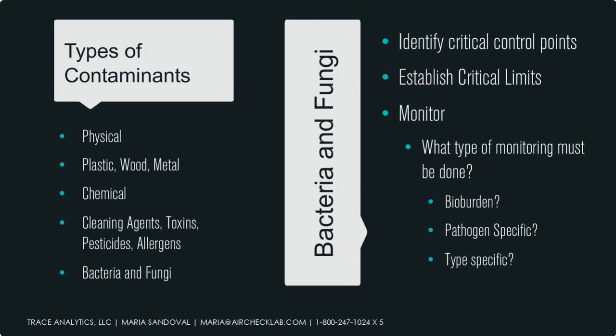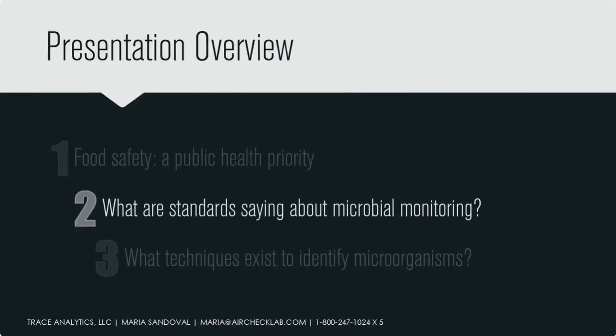Is it good enough to just have a number, or do I need to be pathogen specific? If you've got an entire greenhouse full of spinach, I can guarantee you, you probably need to be pathogen specific. But if you're just boxing up ready to eat meals, maybe you only care about bioburden, or maybe you do care about gram negative organisms. So those are the types of questions you're going to start asking yourself when it gets time to establish the type of monitoring that you're going to do.